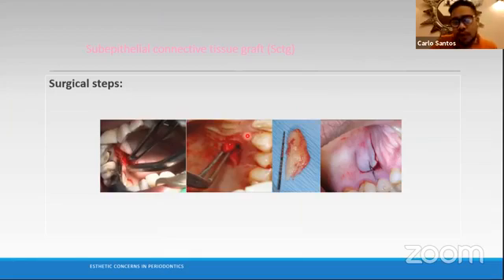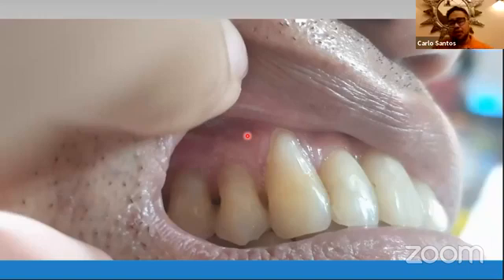So you get your connective tissue from the palate, in the area of your premolars. Okay, why there? Because in the back part are your innervations, and in the front part is your incisive region. So it's in the back of the premolar areas. In this case, our students, our participants, did this.